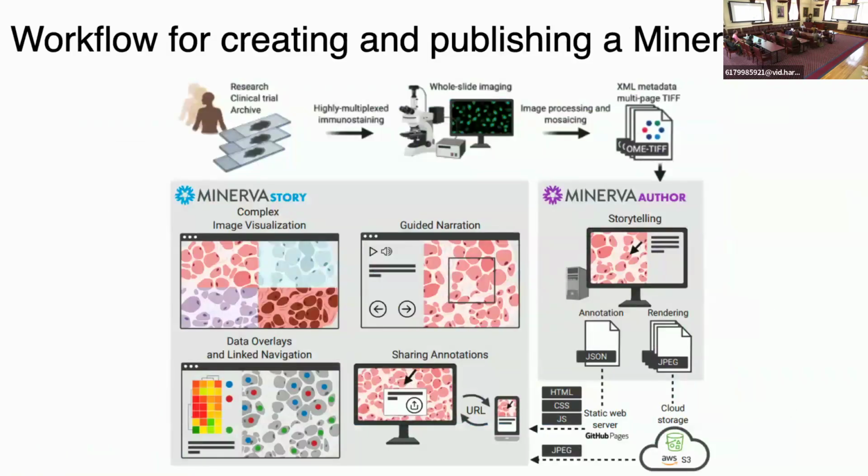The workflow for creating these stories is, after data collection on the top, you load it into our tool called Minerva Author, which is an authoring environment where it lets the author create these different waypoints, write the text, define the channel groups, add annotations, and build the story, build the tour that tells the story they want to tell about their image.